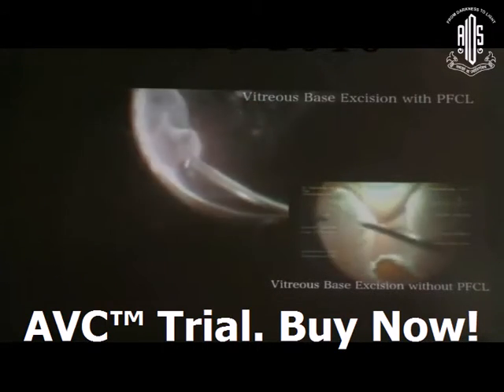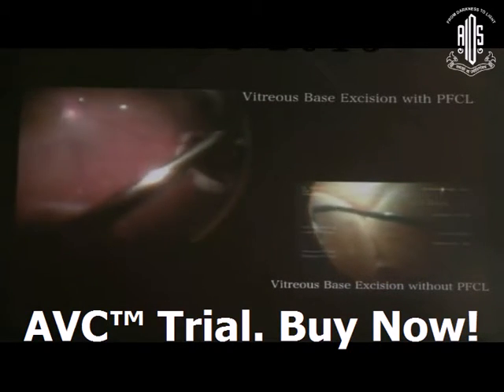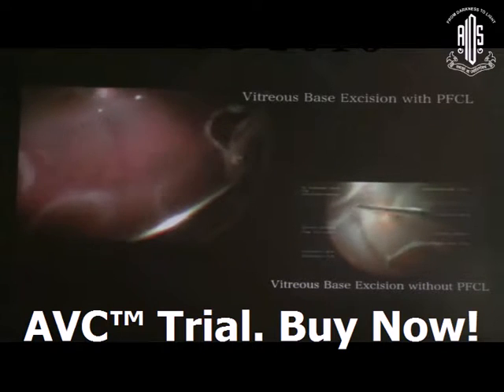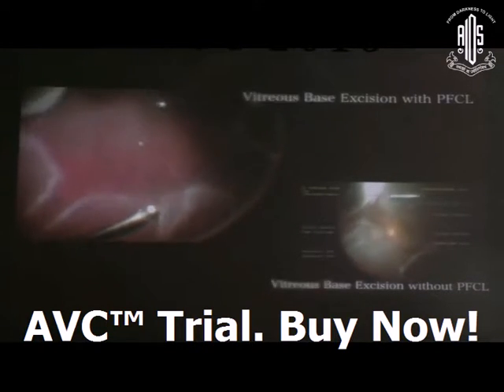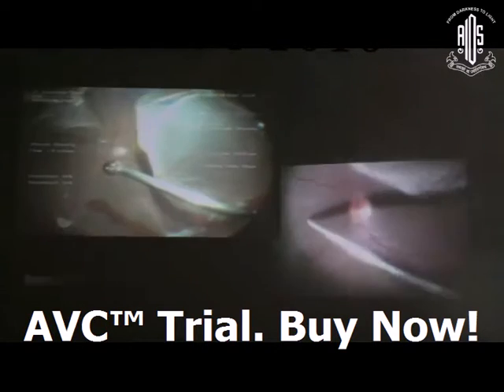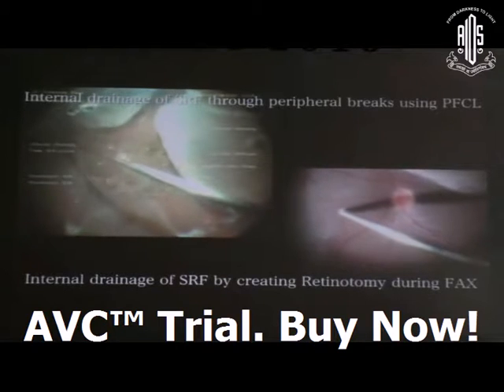Vitreous base excision can be done without PFCL or with PFCL. Without PFCL, the retina may suddenly assume a bullous configuration on the table and jeopardize your surgery. With PFCL, you can always fix the posterior pole and perform PVD induction. The next step is internal drainage of subretinal fluid.